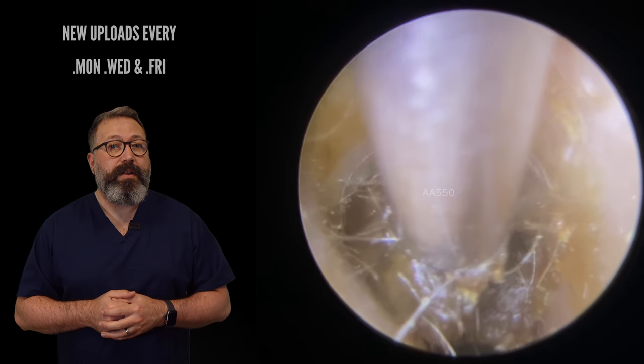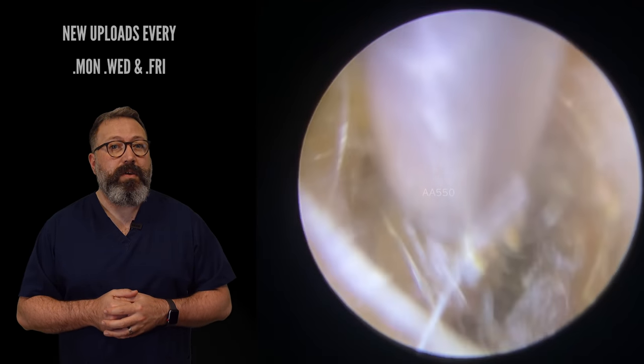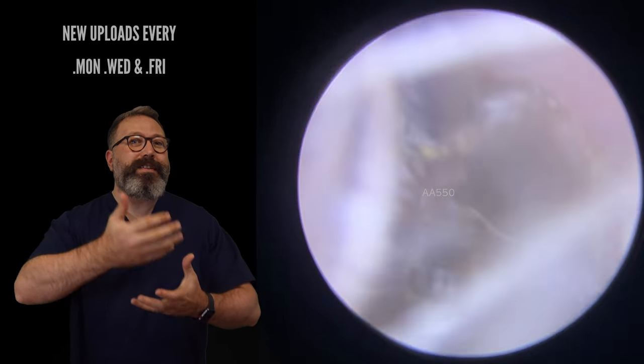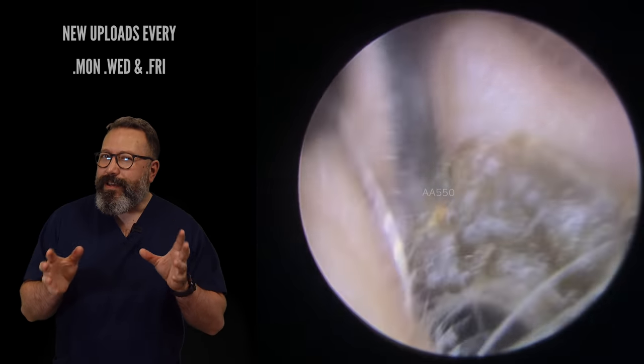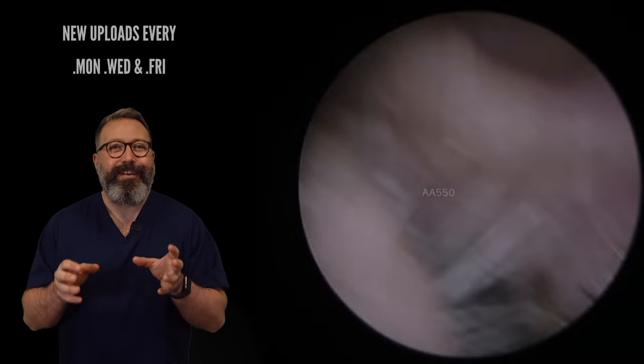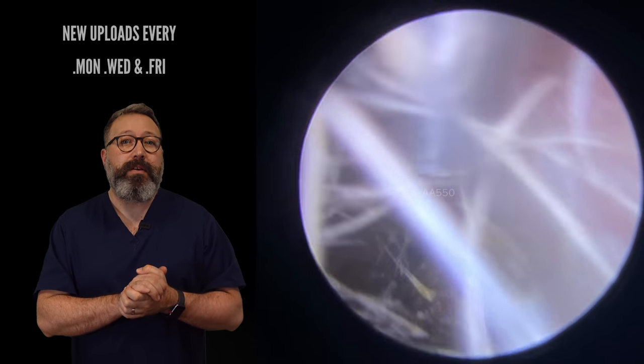So we're just going to give this a bit of a wiggle here — there we go, and out that comes. So we managed to tilt it over. You can see that kind of almost indentation there. Possibly a little bit of Q-tip or cotton bud use on that one.